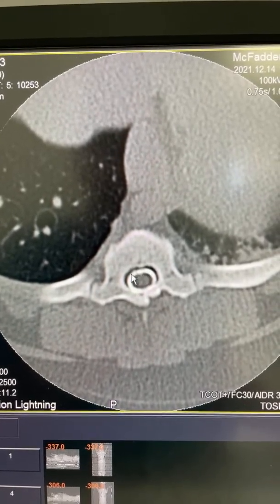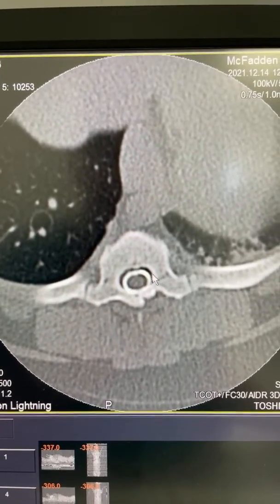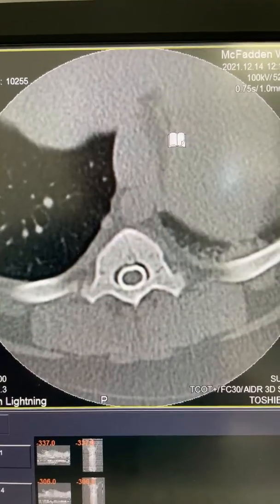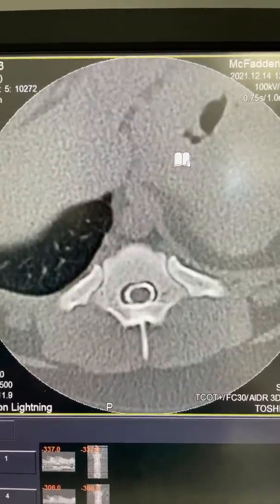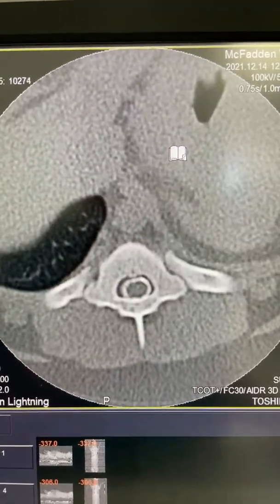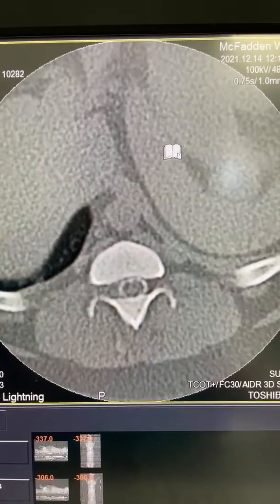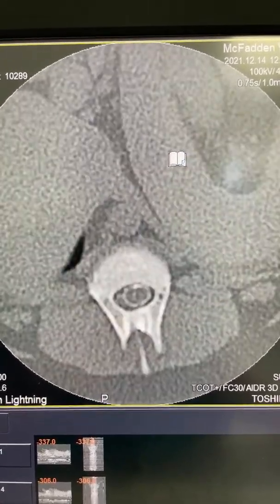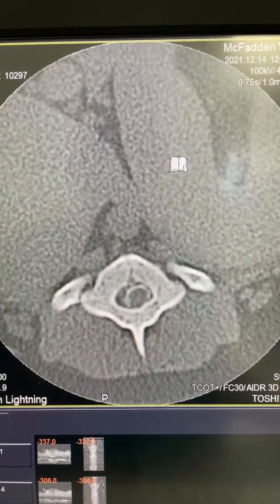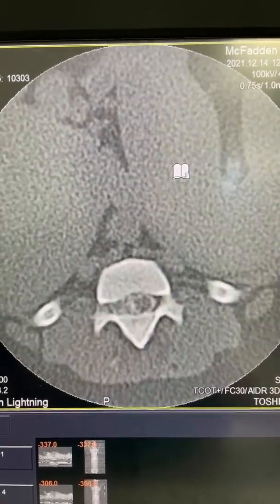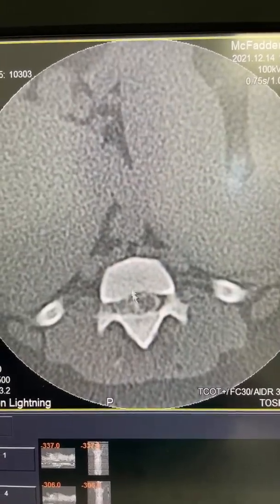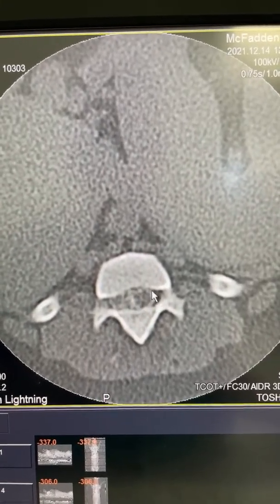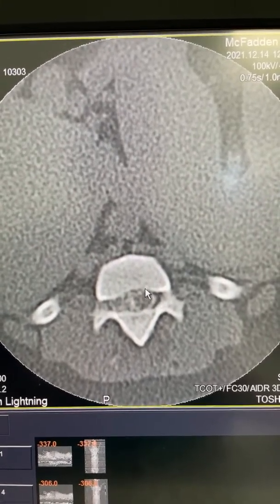So this is the myelographic contrast right here that we've injected into the spinal canal, and then as we head caudally we can see that the myelographic contrast is slowly dissipating and being compressed, and at this point we can see that we've got significant disc that's in the spinal canal pushing the spinal cord over to the left-hand side.